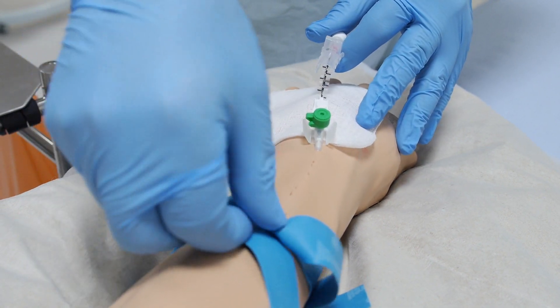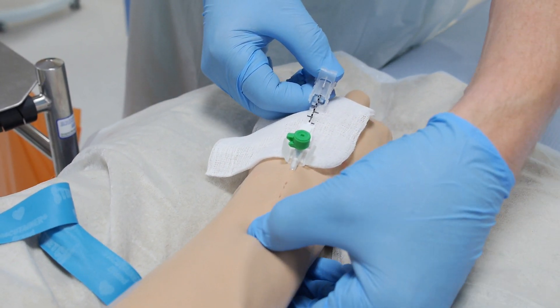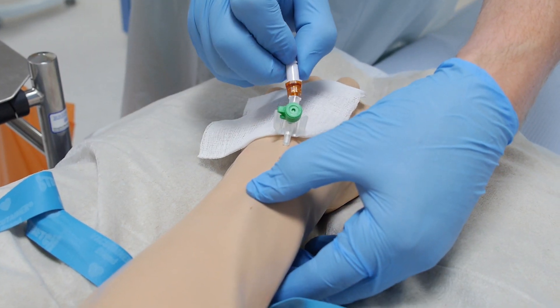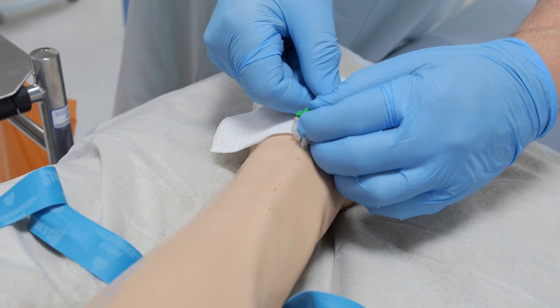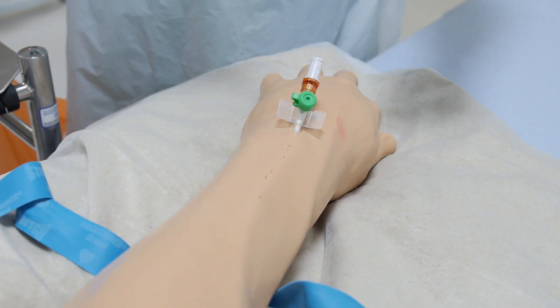Place sterile gauze under the end of the cannula and release the tourniquet. Gently apply pressure above the vein, remove the needle and dispose of it carefully into the sharps box. Allow blood to fill the device and attach a cap or suitable interconnect system. Interconnects tend not to be used in situations where maximum fluid rates are required, for example in emergency departments.